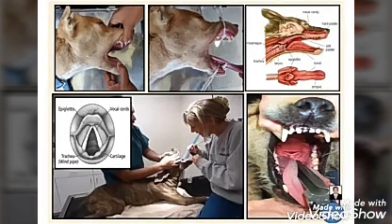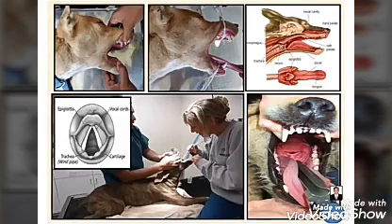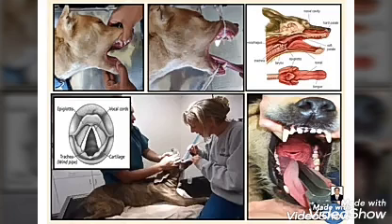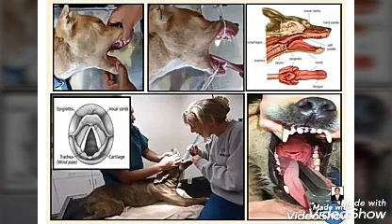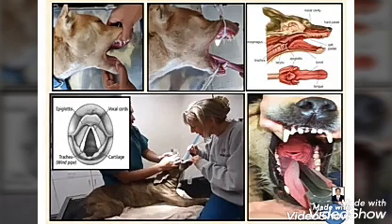Following the successful endotracheal intubation, the correct placement of the endotracheal tube can be confirmed. How to confirm this? Suppose the endotracheal tube is entering inside the trachea, the animal shows mild coughing and passing of expired air through the tube. These are good indicators that the tube is inside the trachea. So the animal shows mild cough in its initial stage when you enter the tube inside the trachea, and the passing of expired air through the tube is very clearly visible.